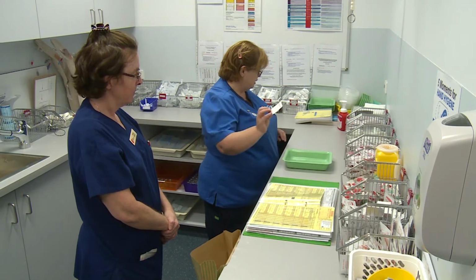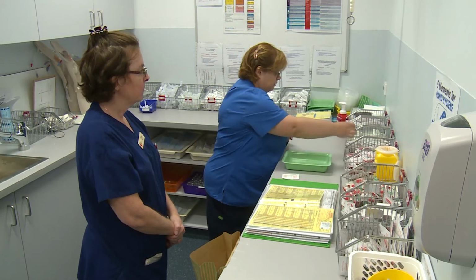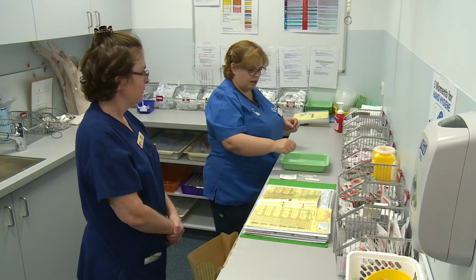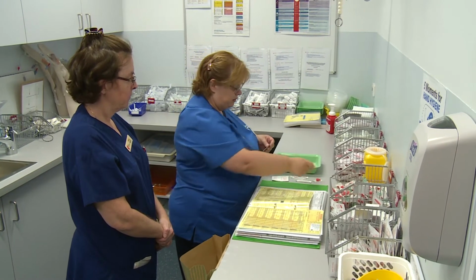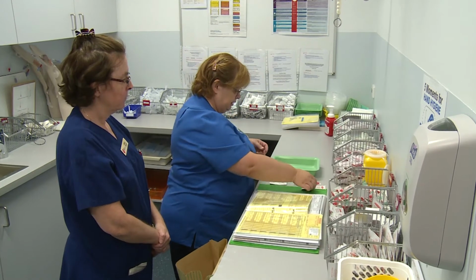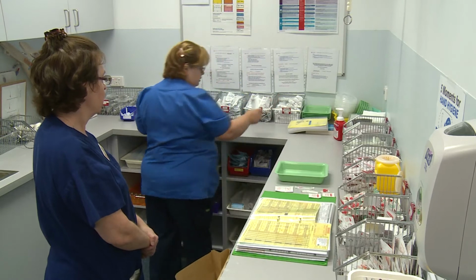Okay, so I'm going to need this to clean my tray. I'm going to need a drawing up needle, a vial access cannula, a red bung. I'm going to need 1 alcohol wipe for my vial to clean the top, and 2 for my patient bedside. Then I'm going to need a 20 ml syringe.